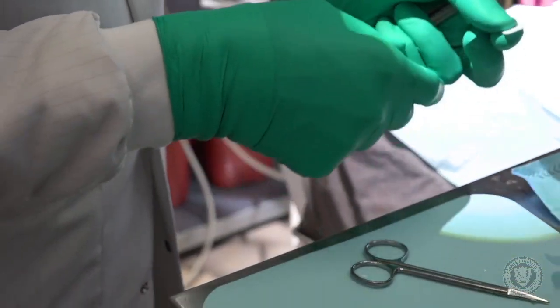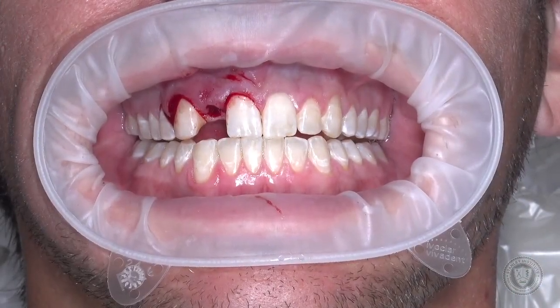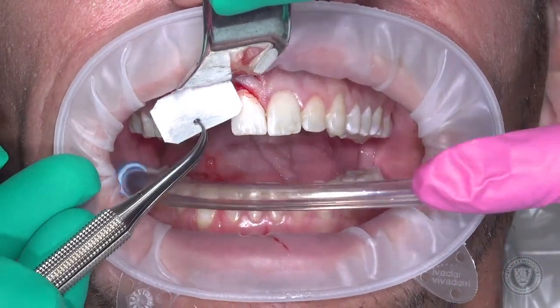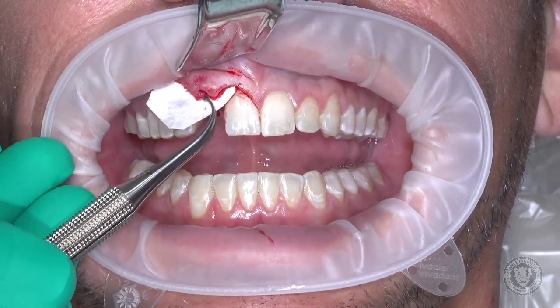I'm using a cross-link collagen membrane. Why cross-link? I'm using cross-link because I want it to hang around longer. The non-cross-link resorbs quicker, and in a case like this I want it to hang around a little longer. So I'm going to try to insert this as my first run here, and then if it's too big I'll go ahead and trim it a little bit more.